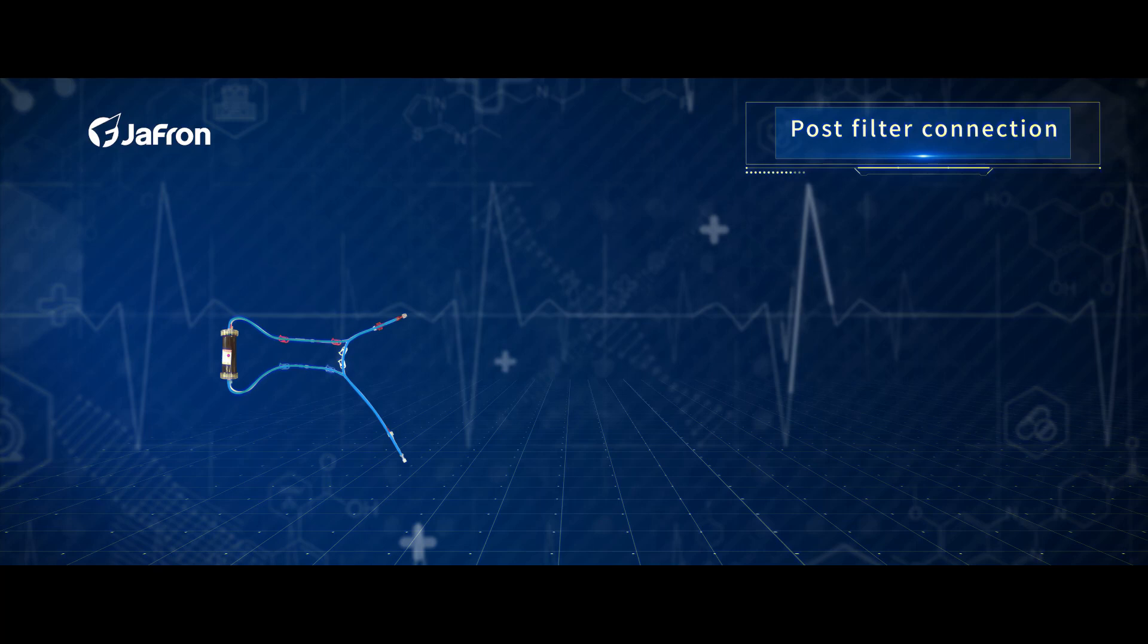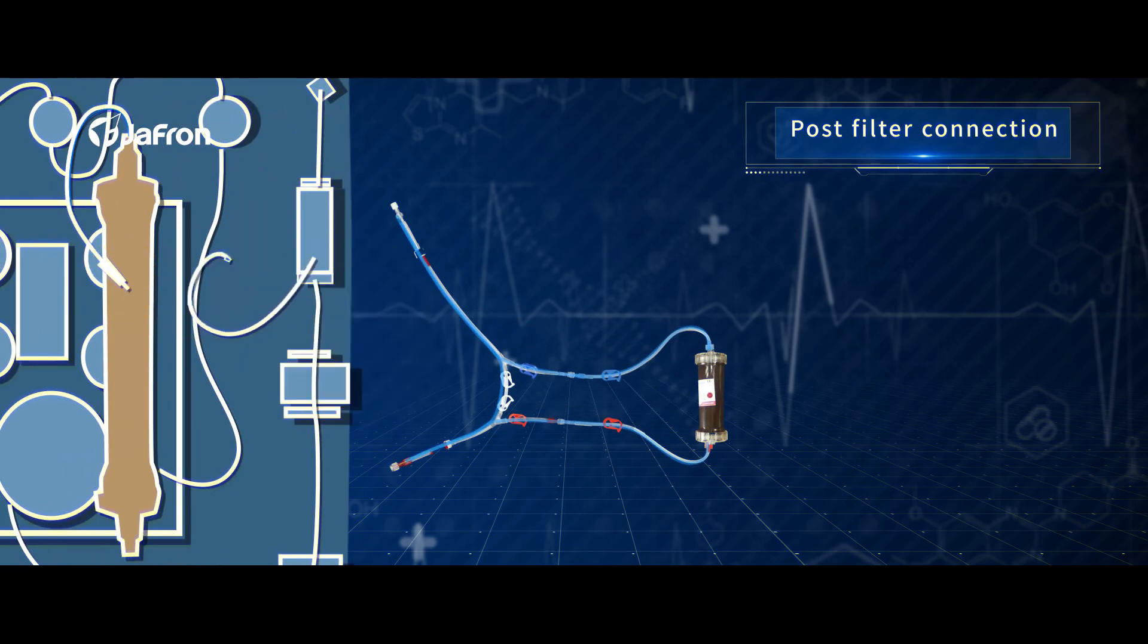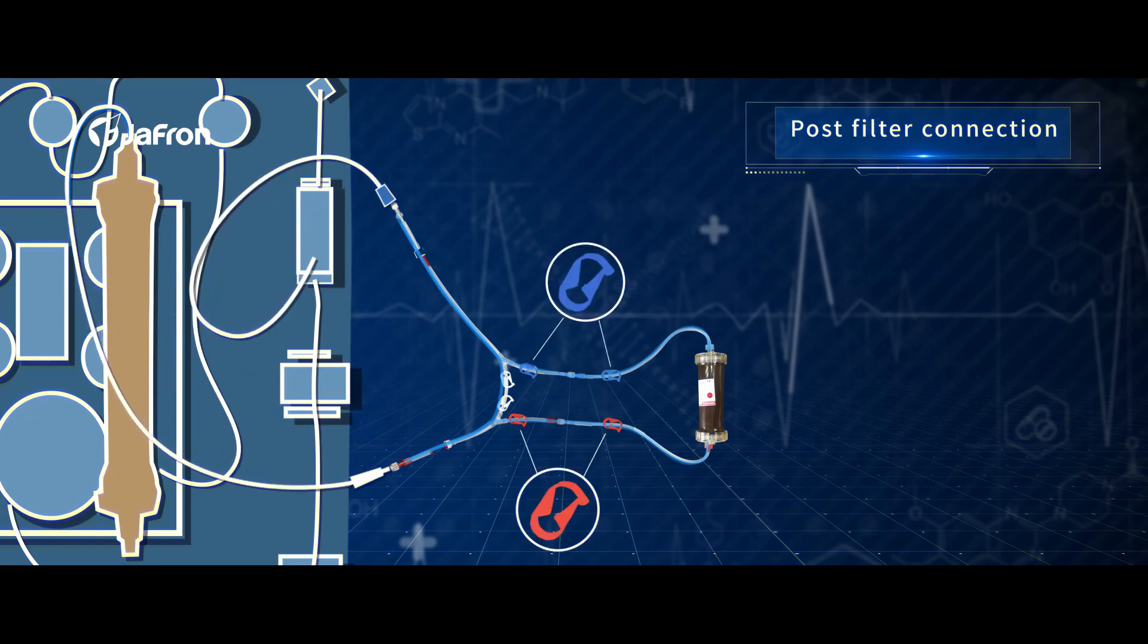Part 5: Post-filter connection. Temporarily stop CRRT treatment. Connect the blood out plus tube to the venous line. Connect the blood in plus tube to the out tube of the filter. Open the red and blue clips on the integrated line set.